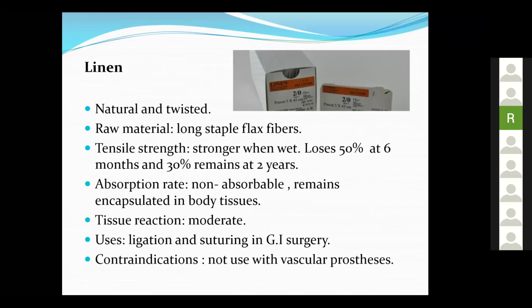The linen is again a natural suture, and we use it. It is non-absorbable, and this causes moderate tissue reaction. It was used in GI surgeries. It is not used very commonly here.